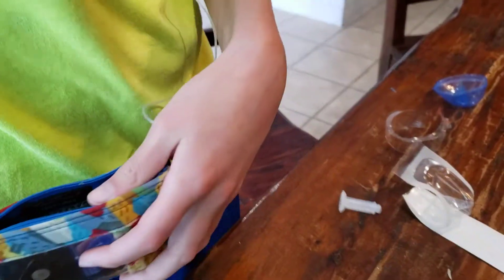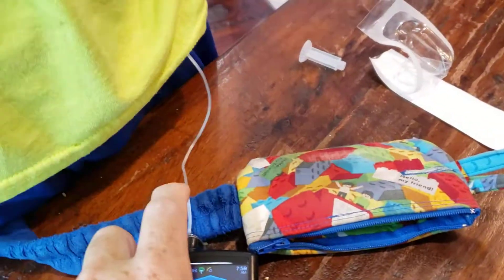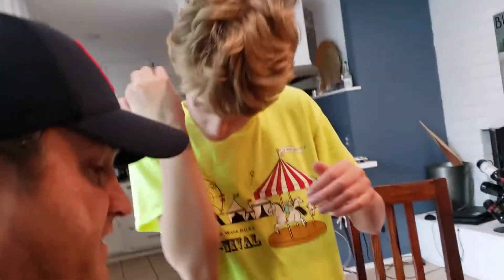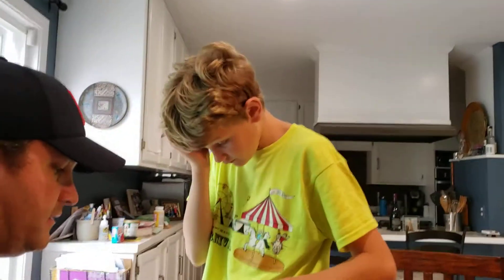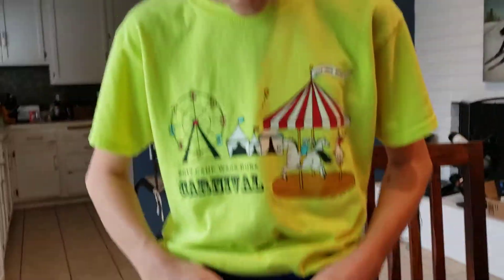So now once we have that, there are a couple options — you can put it right in your belt. Now that it's all set up, I'll pop this out sometimes, drop it through his t-shirt so it comes out right here, and hook it right back in. That way there's no loss in anything for the SmartGuard to keep him in auto mode.